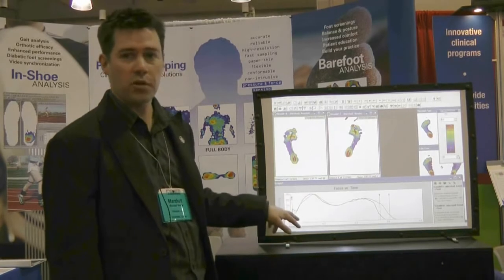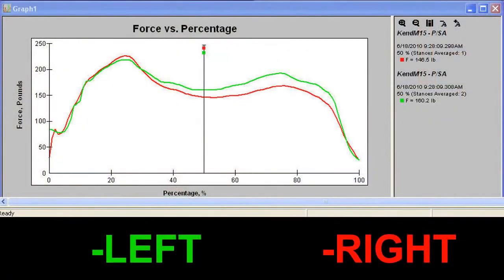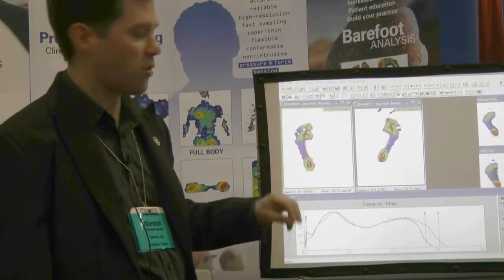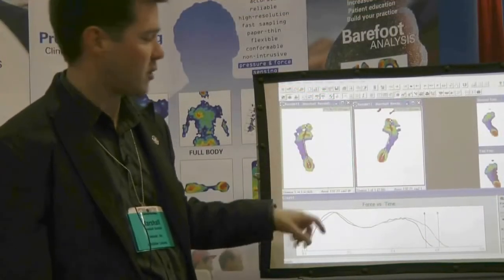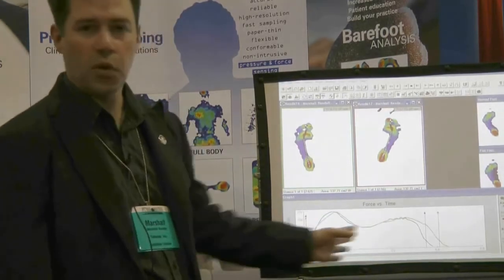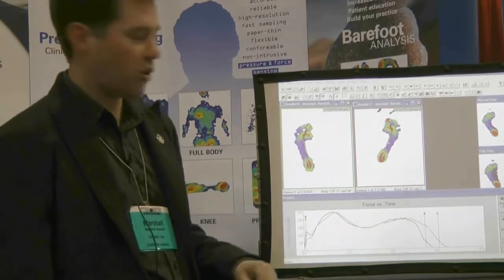We can also show the forces under each foot. In this case we have a green curve which represents our left foot and a red curve which represents our right foot, and we're able to look at the peak heel contact force and compare whether the forces are equal or if there's a big difference between the two. Same thing for the forefoot propulsion — what we're looking for in this case is any asymmetries between the force curves.